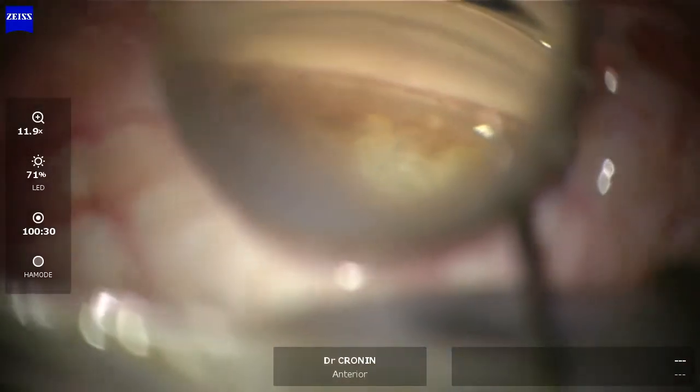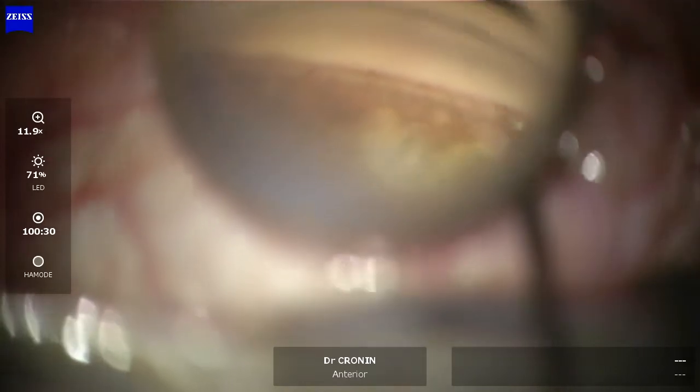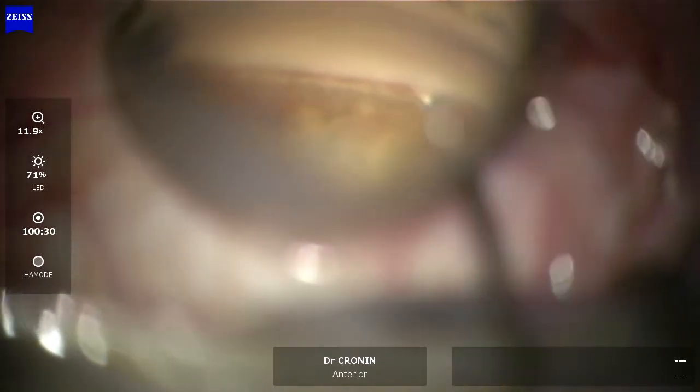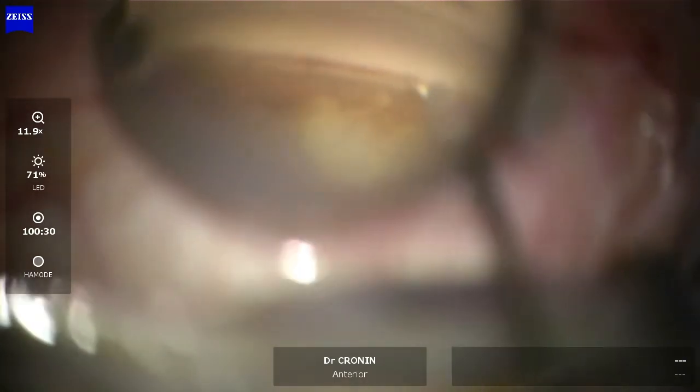Sometimes you'll need to rotate the needle 180 degrees and go in the opposite direction, just depending on your view. I'm using a gonio prism here. There'll often be a small hyphema in these eyes the next day.